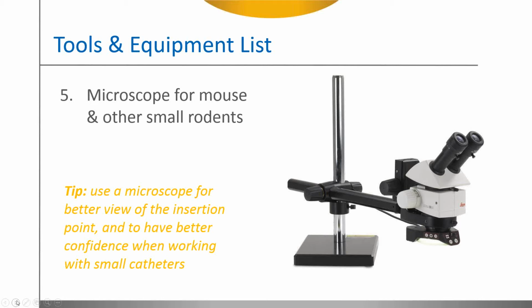Another good thing about the microscope is that it will avoid the necessity to use the end of the catheter as a blunt probe while the surgeon searches for the entrance of the vessel. Once again, it helps prevent any damage to the catheter through blunt force on the end of it or kinking of the catheter as you're pushing against a non-aligned vessel.